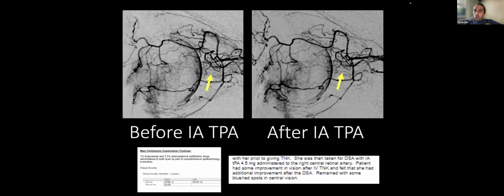Now, another thing I want to say is that we've been doing this quite a few times, in patients with CRAO, doing as good imaging as possible, and the experience has not been that great. I'm showing this case as probably the only extremely convincing one. Together with this, we have a lot of cases, maybe 5 or so, in which by applying the same imaging, the same sort of analysis, we were not able to prove the occlusion of the central retinal artery. So I wanted to remark that limitation as well. Happy to hear comments or opinions.